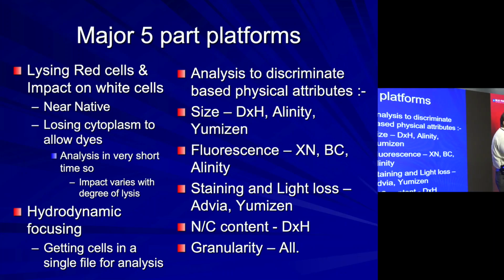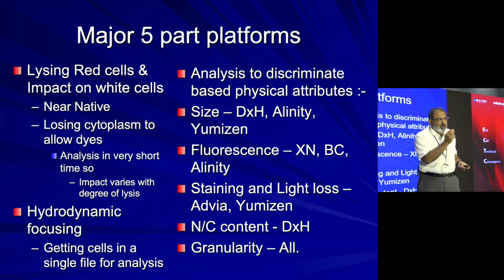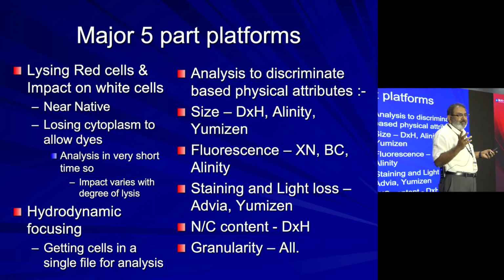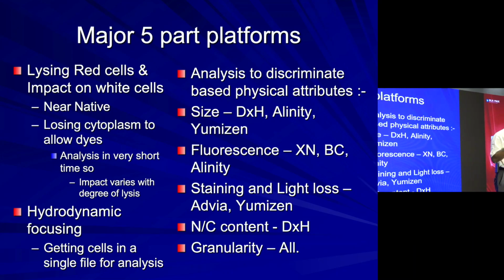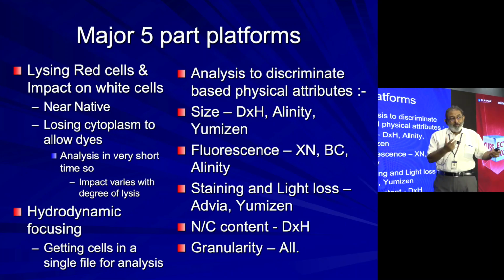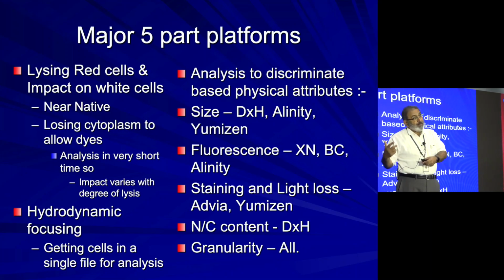The cell counter analyzes and processes cells in 20 to 25 seconds. Don't imagine that the whole cell is in front of me, the whole day in front of me. In front of the cell counter, it's 25 seconds, nothing more than 25 seconds. So what happens to the cell before 25 seconds and what happens to the cell after 25 seconds, we don't know.